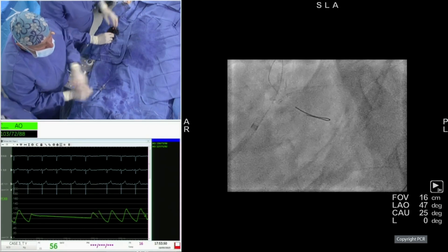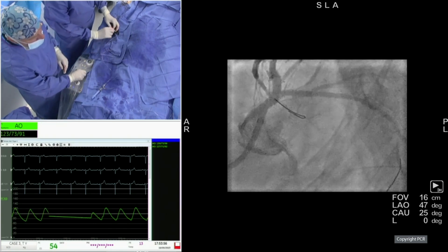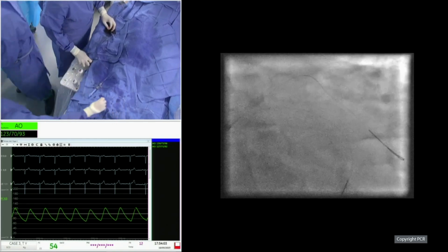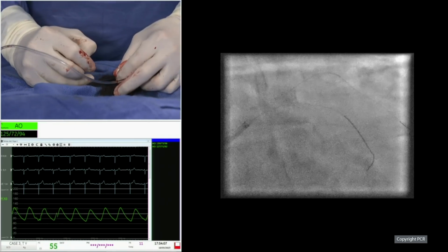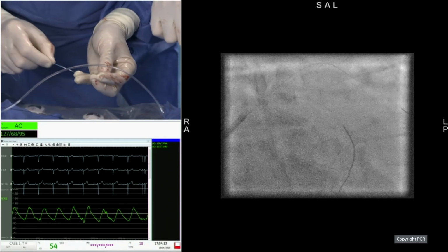Wow. Nice. Okay. It's quite good, hein? Yeah. On prend le 4-0, le 4-8, le 4-5-8. Yeah, 4 minutes I can talk. Et après, on va préparer l'OFDI. Yeah. Vas-y. C'est sûr, celui-là. Ok, c'est celui-ci. Ouais. So, for 5 minutes.